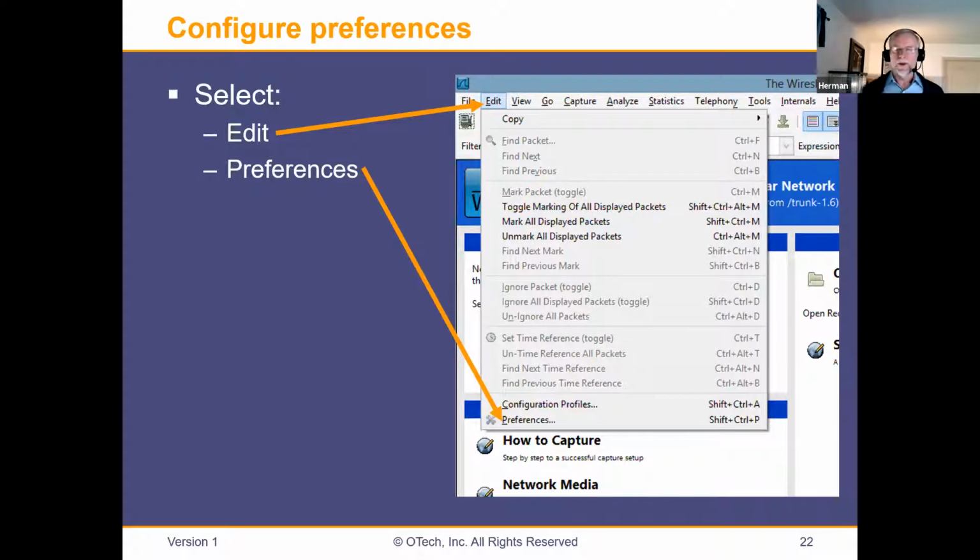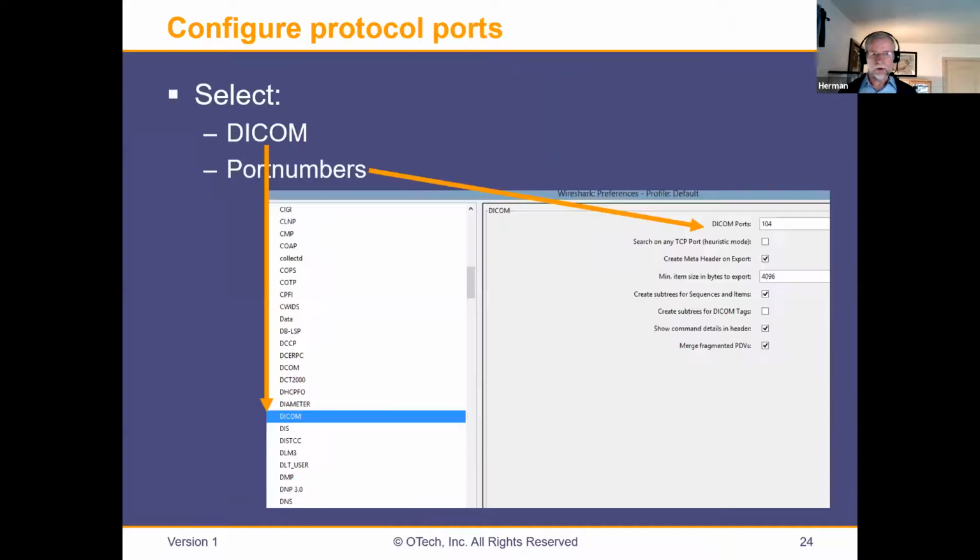So you install Wireshark. The first thing you have to do, you need to make sure that you connect the port that you're listening to. You need to make a connection between that port and a DICOM interpreter. So very easily you select Edit on the main menu and go to Preferences. See Edit, Preferences, and then you look at all the protocols. Under the protocols you select DICOM, and you say I want to listen to port number 104. Yeah, port number 104. Right.